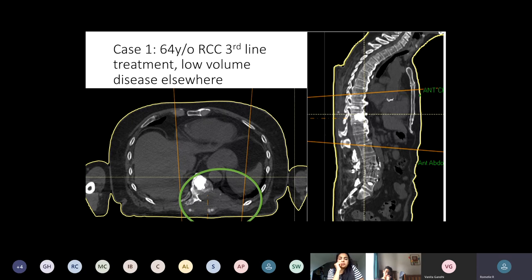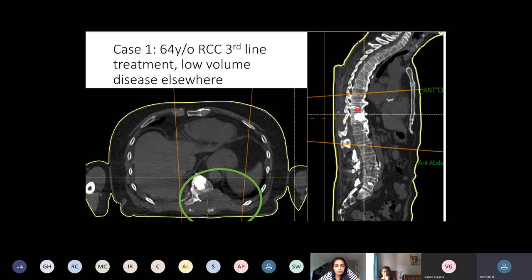This is a 64-year-old gentleman with renal cell cancer on his third line of treatment — a real case from a couple of weeks ago. You can see his disease in the middle of the field, tracking down to his main site of disease. He's had an operation; you can see the green circle highlighting where he's still got lots of disease, and there is metalwork — a metal plate all the way down fixing into his vertebrae. Considerations: what dose are we going to give, do we cover all the metalwork, does renal cell carcinoma change things, and what's the rest of his disease like?